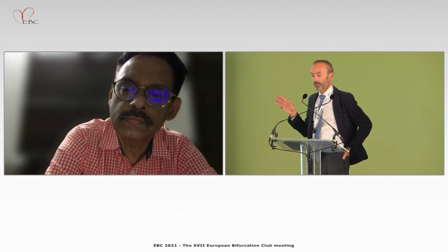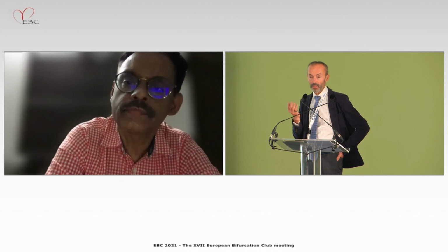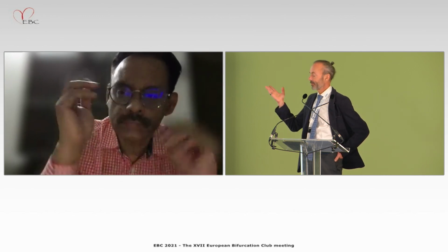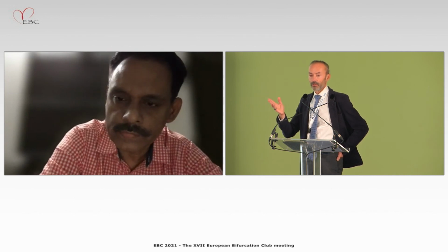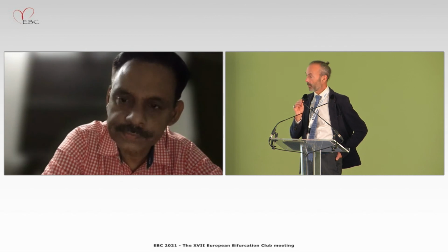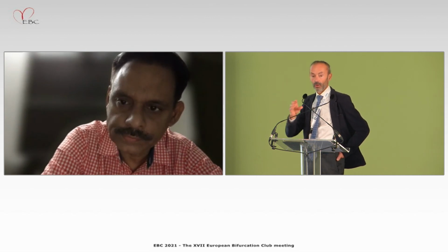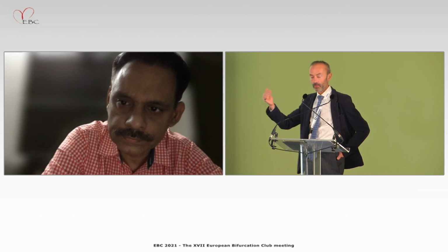In this case, in particular, they used a 4.0 balloon for the POT, but the circ was maybe 3.5. It was bigger than the LAD, so probably 4.5 was a good POT balloon in this case based on the Murray law. So this is probably one of the reasons why the repot didn't work.